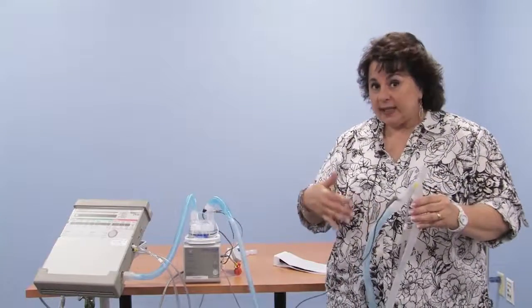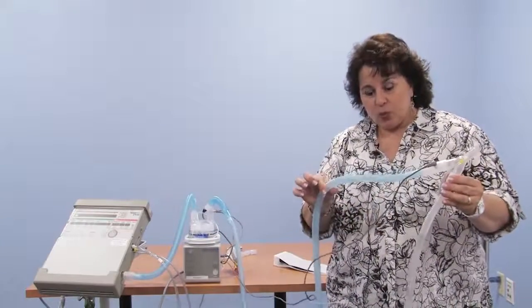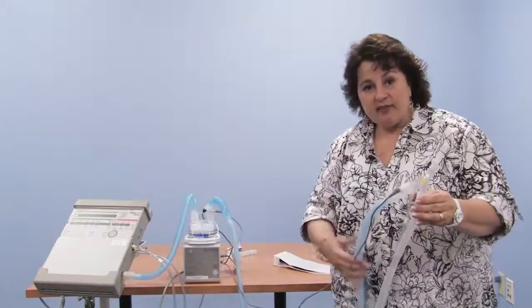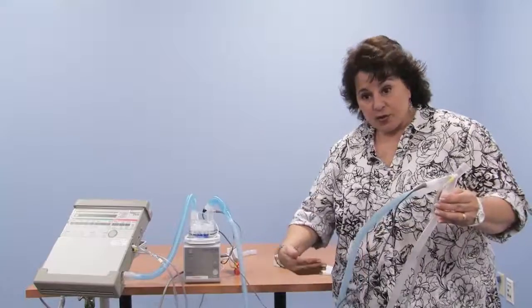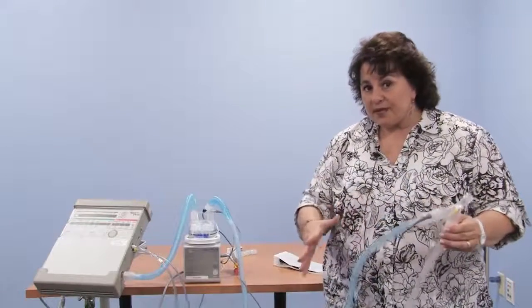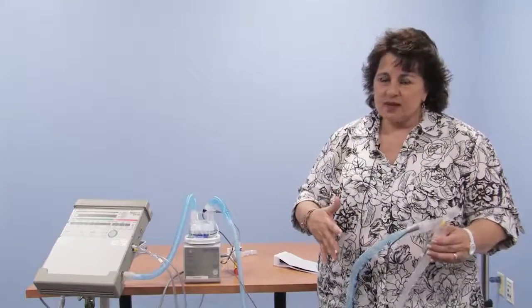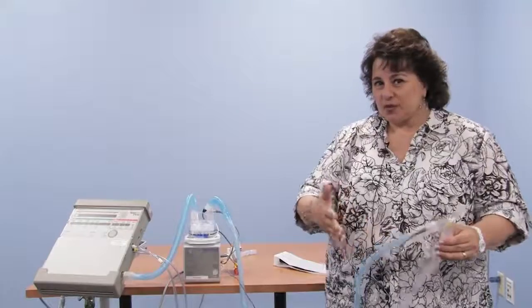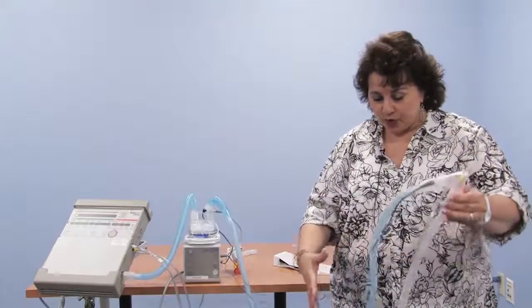So we're using heated humidified tubing with heated wires. You can use this without the wires. You will have more puddling. There are circuits with water traps in them for those that don't have heated wires. So there are many different circuits available. Please discuss them with your DME company, your DME therapist, about what best serves your child and your needs for your child.